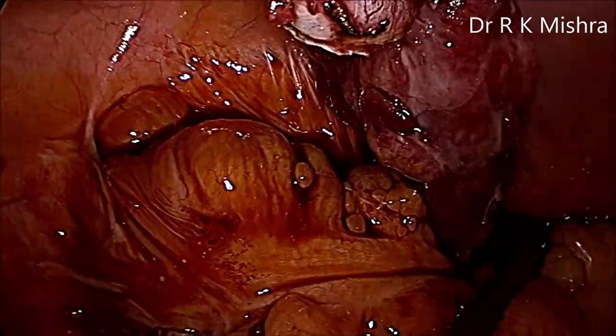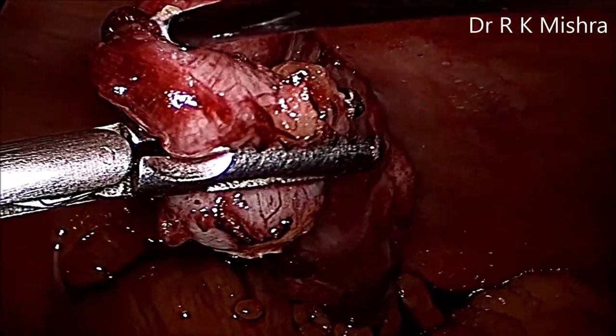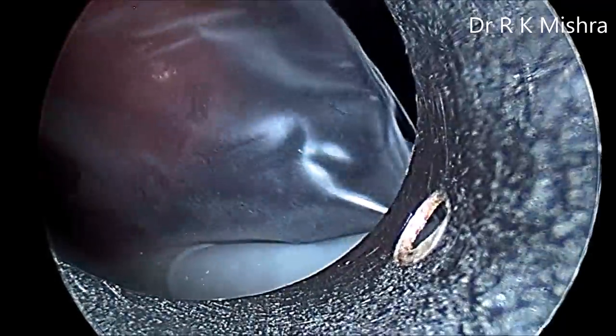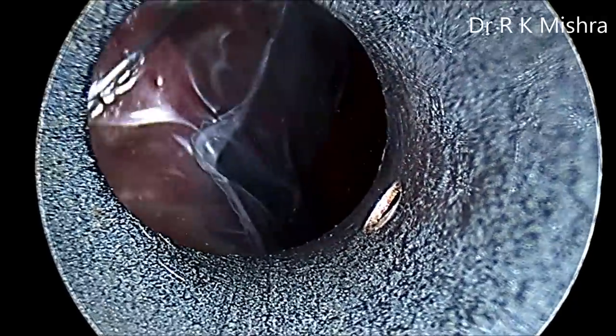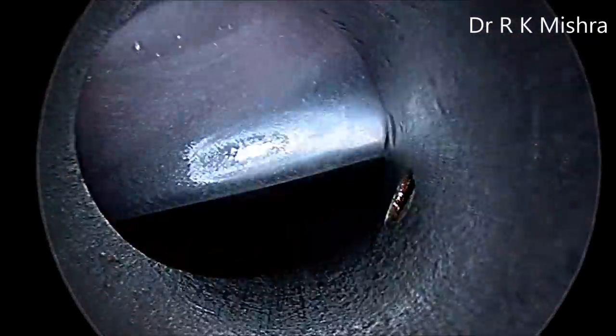After that, we will change the telescope. This is the 10 mm telescope now. Now the 5 mm telescope will be introduced into the left iliac fossa, and we are using a high quality endo bag. This is the Endo Catch from Covidien, which has a metal ring and is a self-retaining endo bag. So you put in the endo bag, and the telescope is right now 5 mm, and the appendix will be taken out through the umbilical port. After opening the mouth of the bag outside, you can put an ovum forceps and take the appendix out. So this is an ovum forceps taking the appendix out.